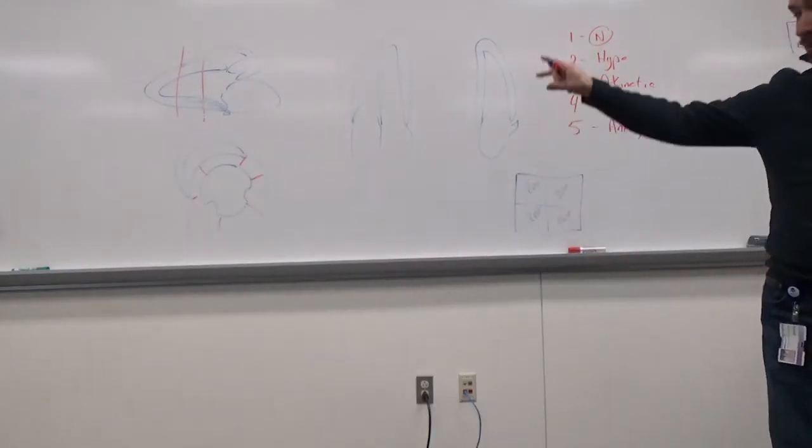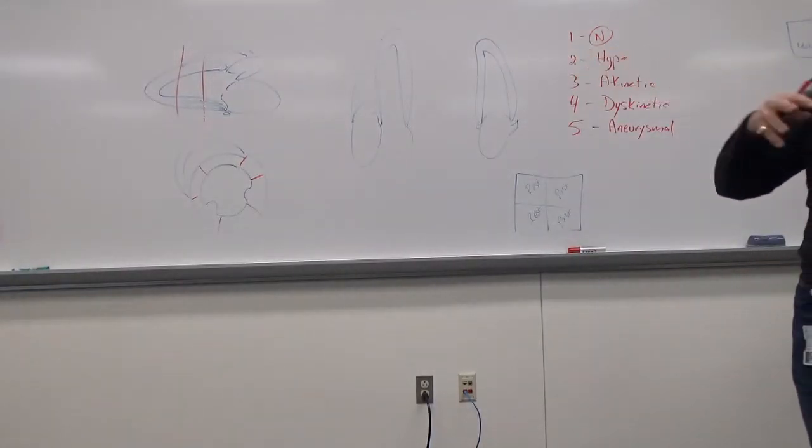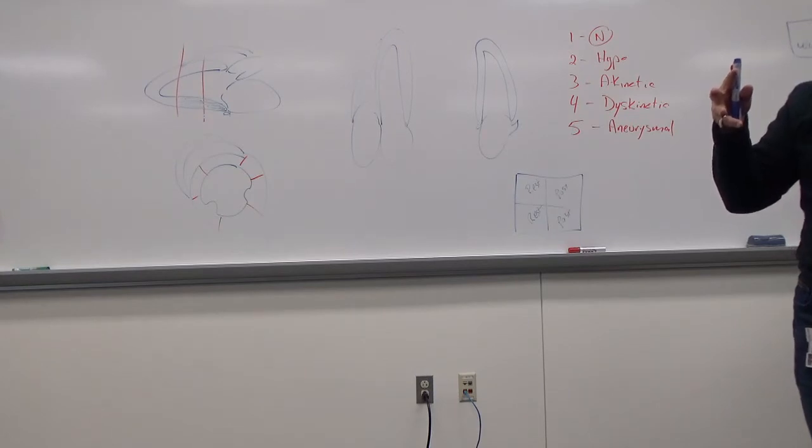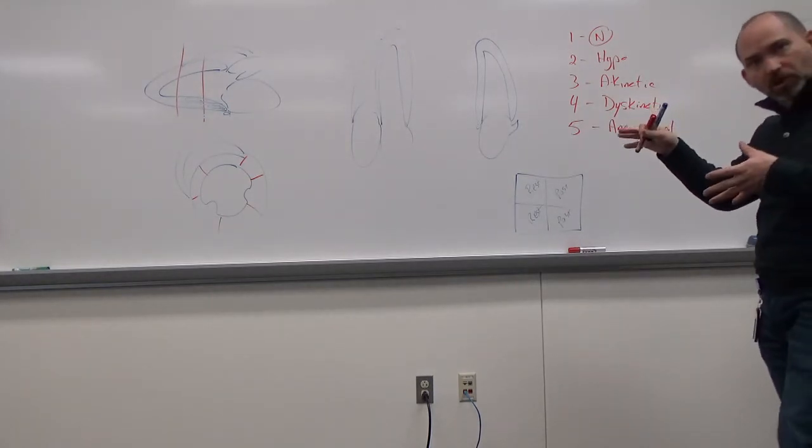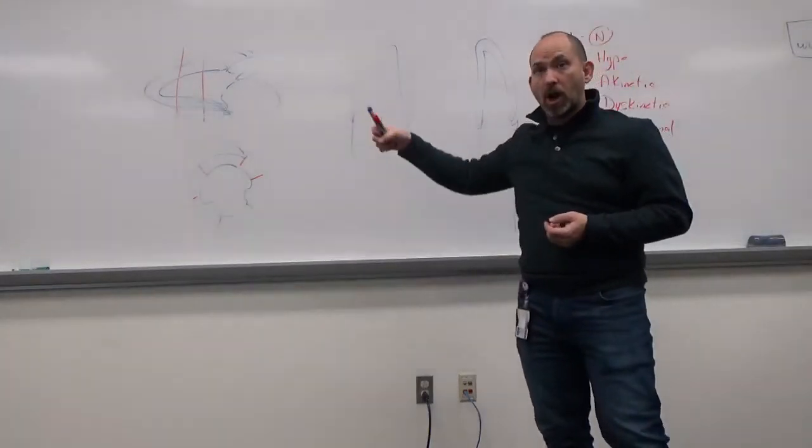Okay, often we still go for wall segments first, because if we're out of that 60-second window, we're going to miss it. So we do the walls first, and then we'll often do some Dopplers after the fact.